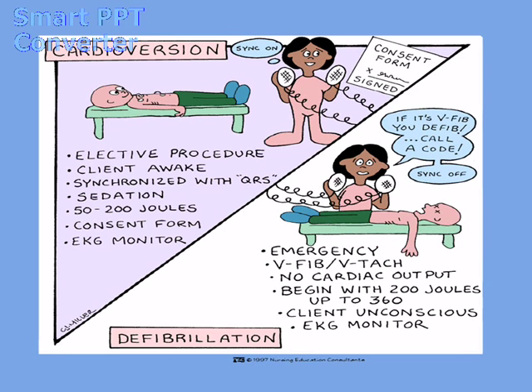Cardioversion and defibrillation. I love this little slide here. This is from the Nursing Education Consultants. I got it a number of years ago, but it's a great slide. Cardioversion is the delivery of actually a synchronized direct countershock to the heart, where defibrillation is a delivery of unsynchronized direct countershock to the heart. Defibrillation stops all electrical activity of the heart, and it then allows the SA node to take over and reestablish a perfusing rhythm. That's the goal that's behind it.